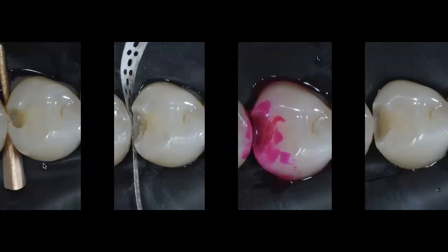But if I'm afraid that I'm going to nick that neighboring tooth for whatever reason, maybe the cavity is very small, the preparation is small, and I want to try to be conservative, the size of the burr, a 245 or a 330, may be too big for this specific preparation, then you can use a lightning strip, which is a metal strip that has diamond. And I normally use the blue, the red, and the yellow. And I go in and I just shave the enamel. They only have the diamond on one side, so the other side is not going to do anything to the neighboring tooth.